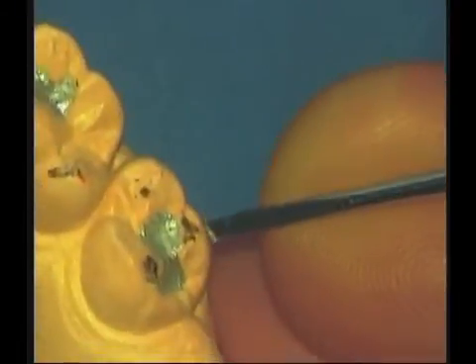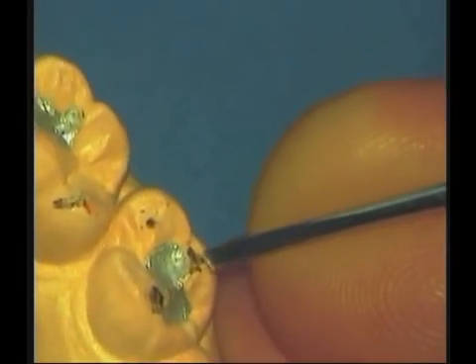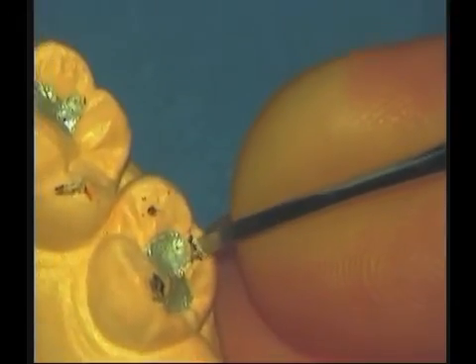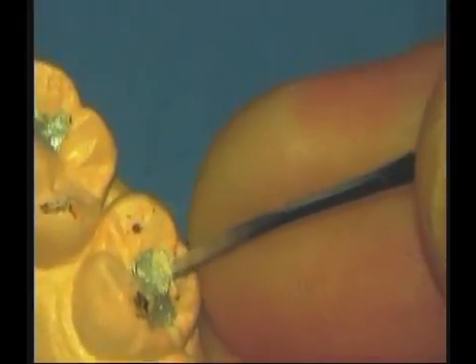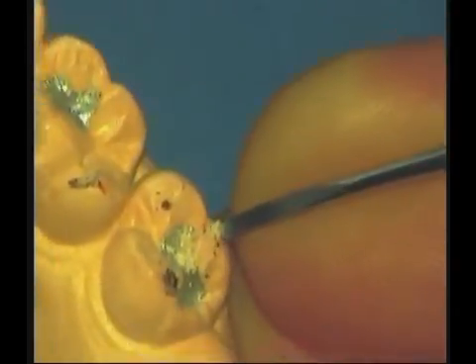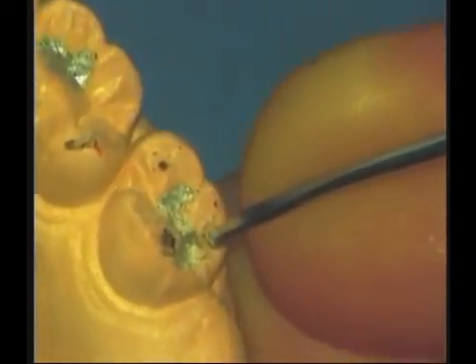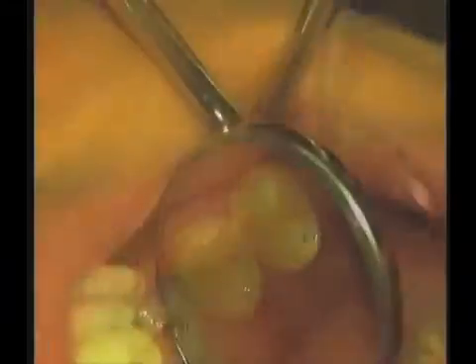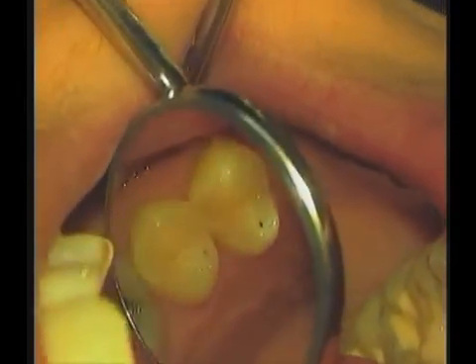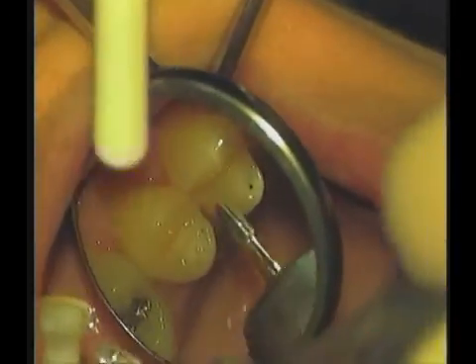I will remove the mesial-most part of this mark, and I will do it in such a way that the triangular ridge to which I'm adjusting is actually moved more posteriorly. Now we're going to adjust both equalizing B contacts on the patient's upper left first and second premolars.